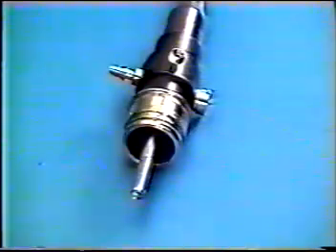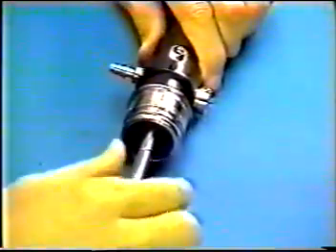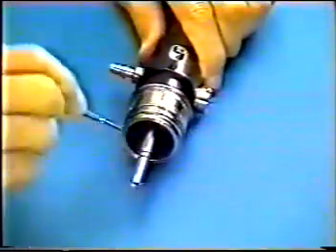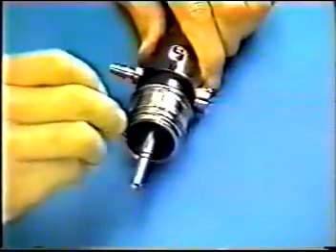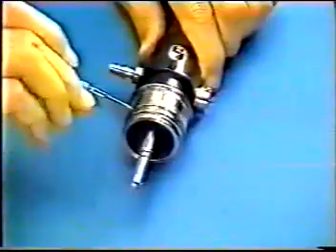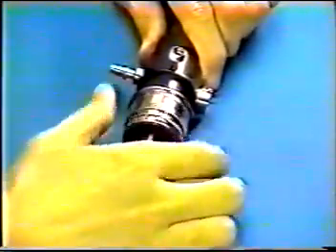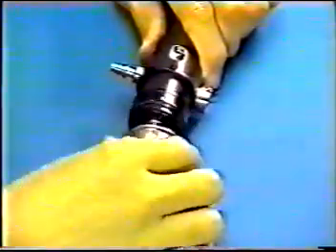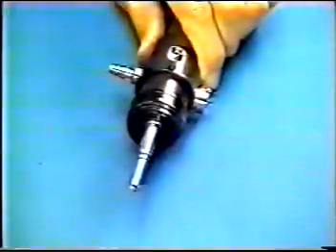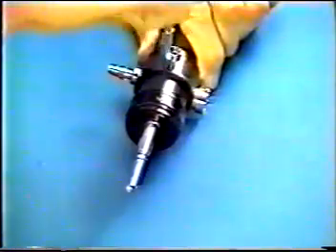Disassembly of light guide connector. First procedure is to remove sleeve from guide. Loosen the set screw at the guide. Loosen 2 set screws and remove connector ring by rotating counterclockwise. Remove 3 screws.